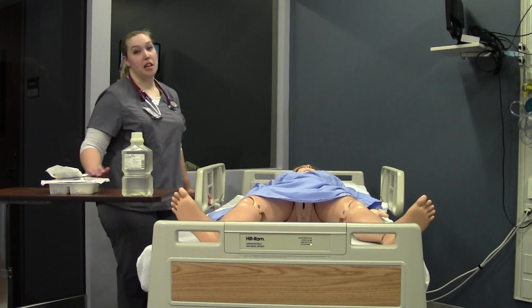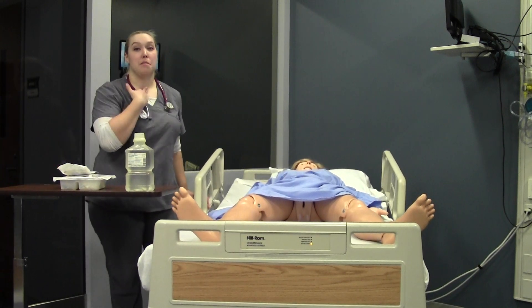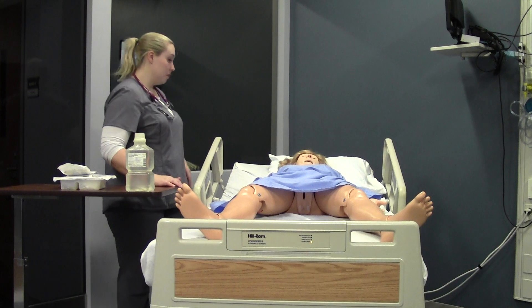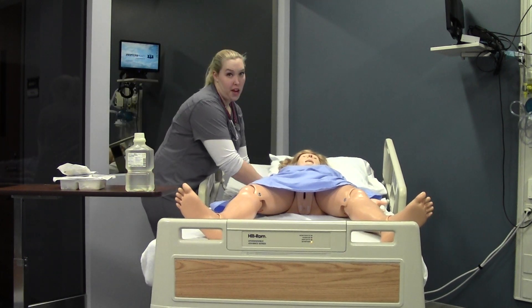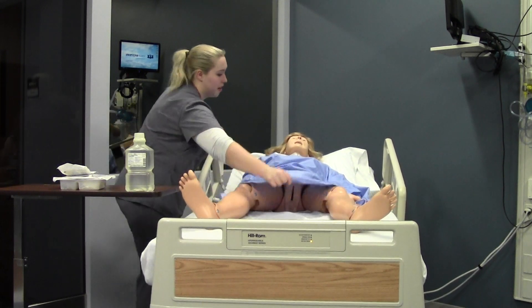Patients with trachs typically, if they're new, can't speak quite yet unless they have the Passy Muir valve, which Mr. Smith does not. So you'll have to ask yes or no questions.